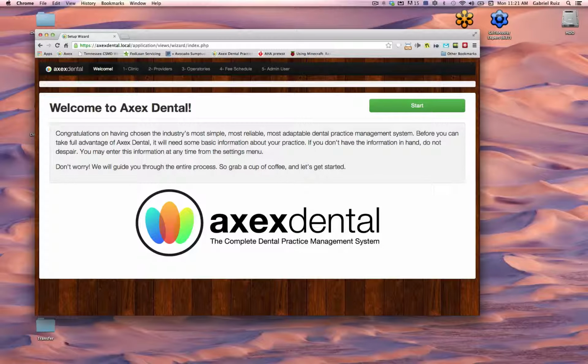So here you are. Welcome to our software. We're going to be guiding you through the process of setting up this machine today. When you're ready, hit start. Make sure that you have any basic information from your practice ahead of time. There's some information that it will not continue on until you have entered it. If you don't, you can always put false information there, something just to hold the space until you have the information, and you can change any of this information if you make a mistake within the actual setup of the software.